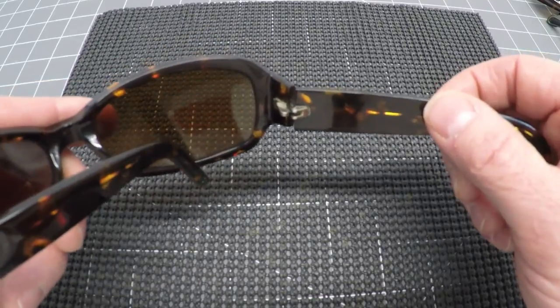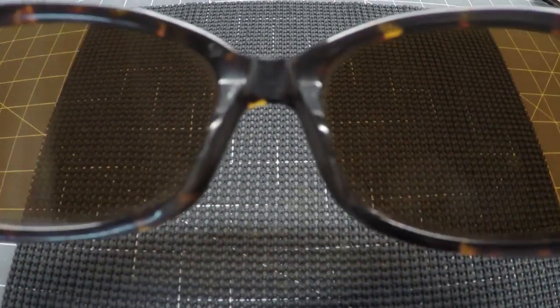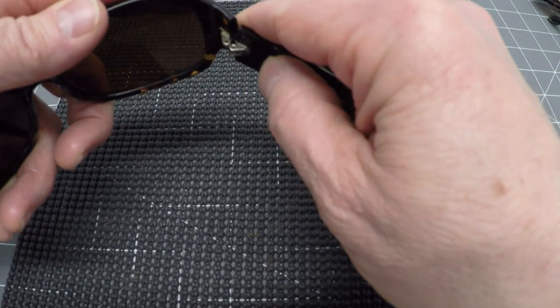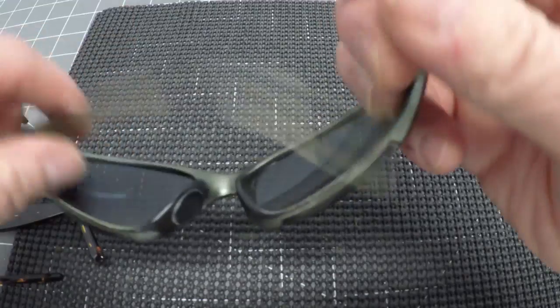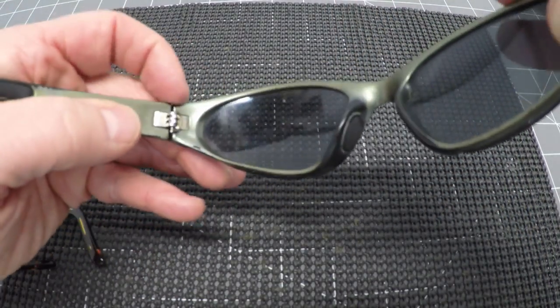Interested? Here we go. So this is a pair of my wife's favorite sunglasses and they're prescription, so we really don't want to cash them in, throw them away. Here's a pair of my sports sunglasses, and you can see where I've made the repair already. It's just a simple D-ring.